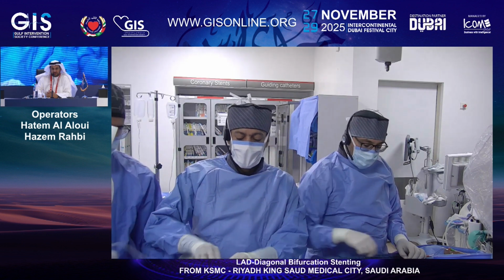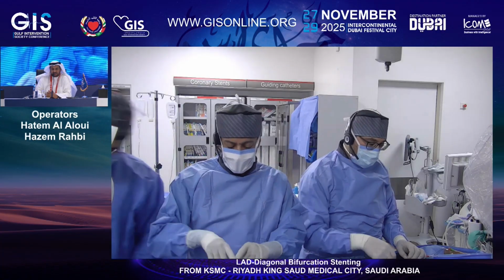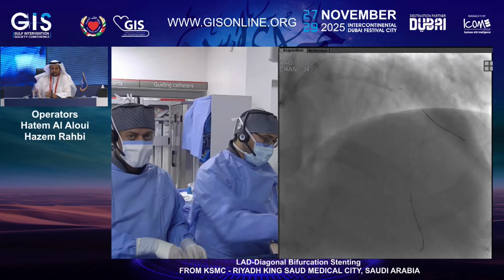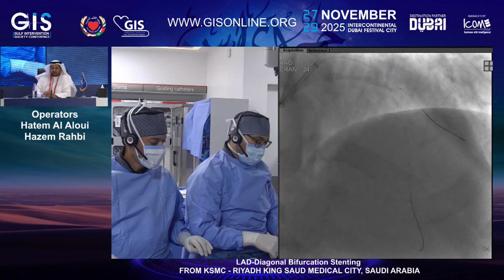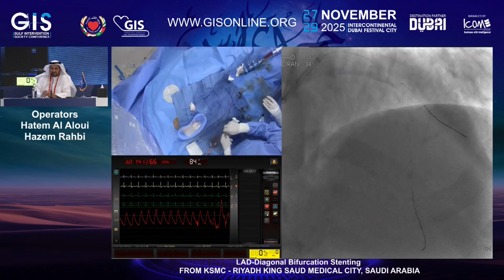Can we see the angio? We don't see the angio. 275. So, may I have a comment, Doctor? Can you open the angio, please? Yeah. Let him answer, and then. So what are you using now?